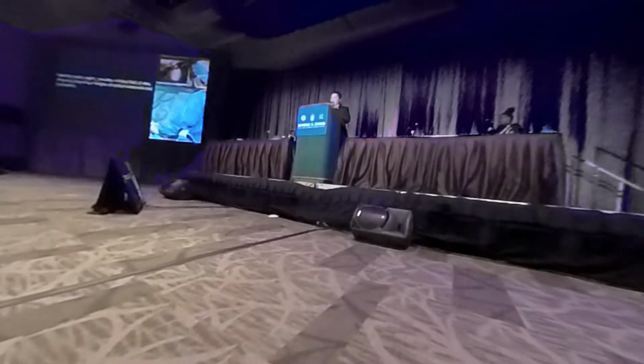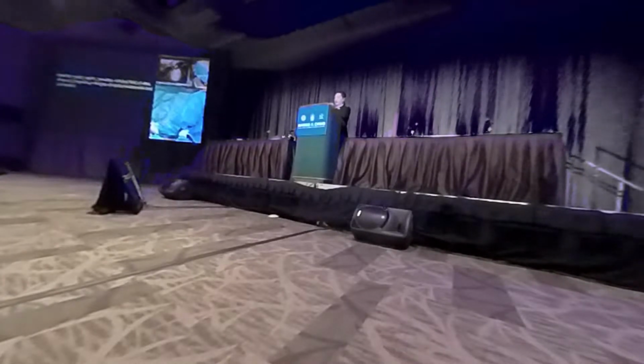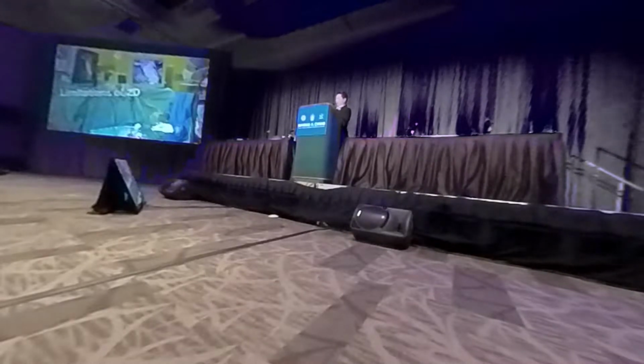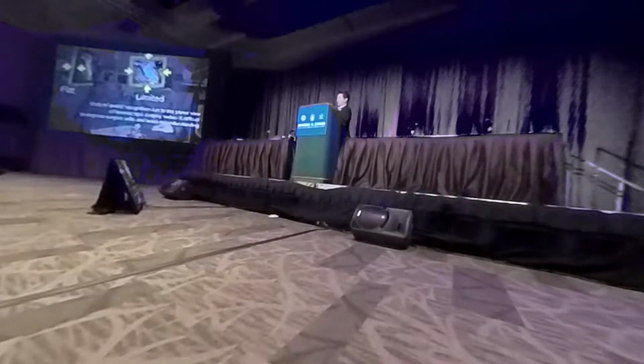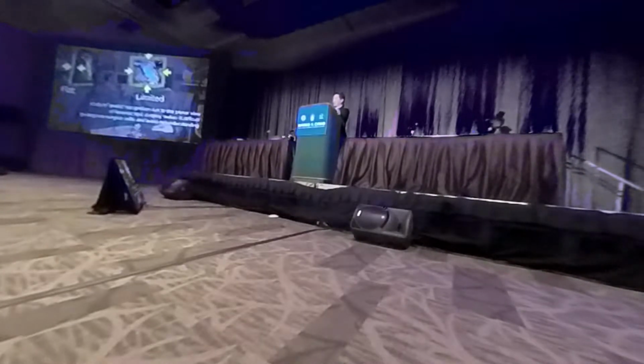Laparoscopic surgery provides a limited field of view, thus requiring a high degree of spatial awareness and orientation. However, there are limitations of the 2D monitor. The disadvantage of 3D imaging displayed on a 2D screen is limited depth appreciation. Lack of spatial recognition due to the planar view of laparoscopic surgery makes it difficult to improve surgical skills and avoid misunderstanding.